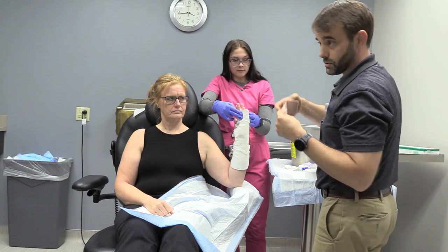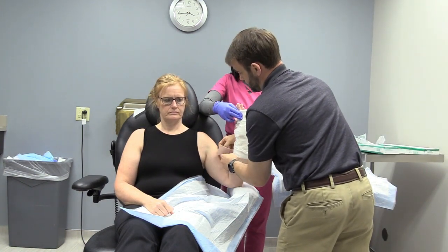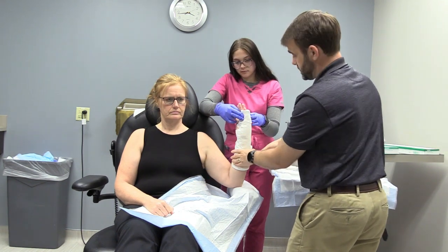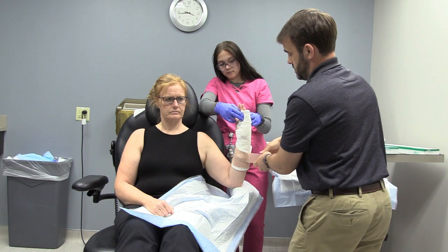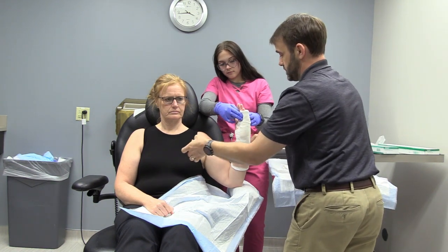Ace wrap is acceptable too, but the thing about Coban is you don't want to stretch too much. So what you do is you bring it out and then you let it come back a bit, so there's just a little bit of squeeze on there. You never want to stretch it as you wrap it because you'll get it too tight. That's a very common reason for people to come back, is a splint that was a little too tight.